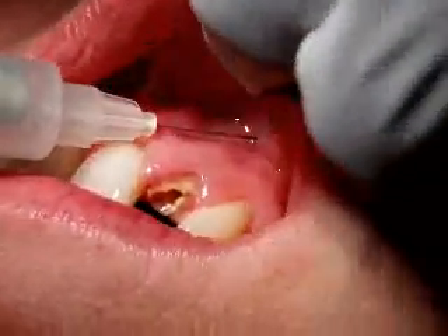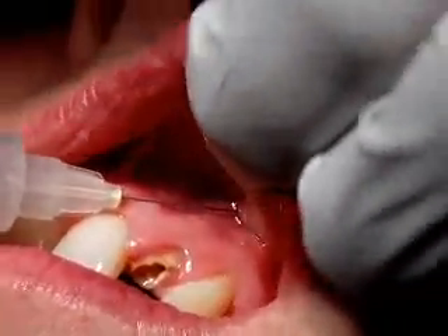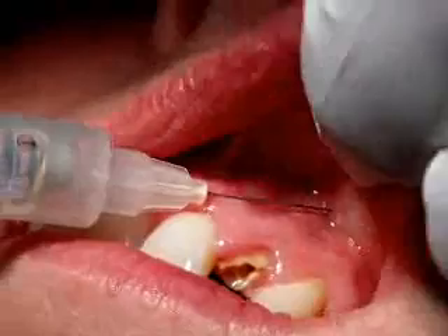So there we are, just popping it in, wiggling the tissue round so that the local anesthetic is moved into the mucosal layers, but keeping the needle itself quite steady.